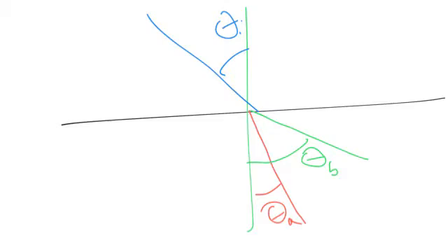So this is known as a critical angle artifact. Remember I said critical angle was the loss of signal just due to refraction. Well, this is it. So when you see these round structures and you see shadowing along the sides, it's because of what's called critical angle, and that's refraction, and the sound is just simply lost. It's gone bye-bye. How do you correct it? Change the angle of your transducer.